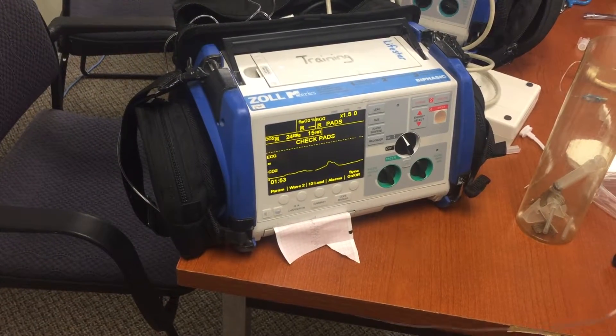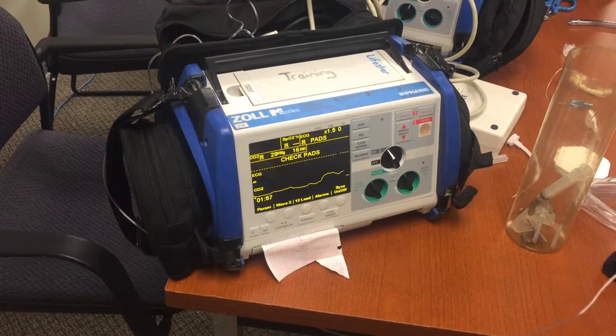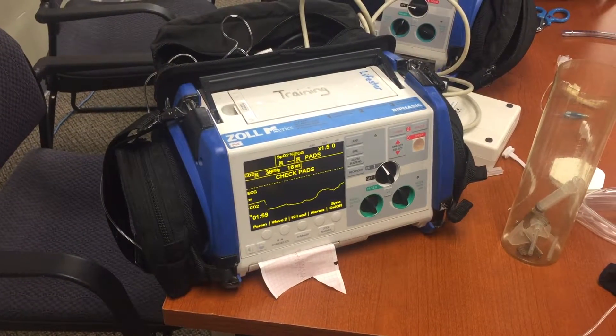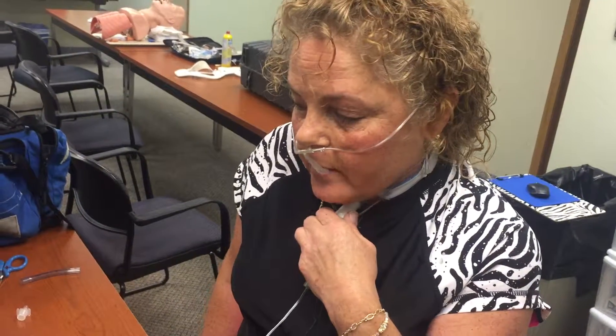Now you'll see it — unless everyone's still up some. There we go, that looks like we got more. Excellent. And if I take off the speaking valve, you'll see very little goes out my nose, but some.